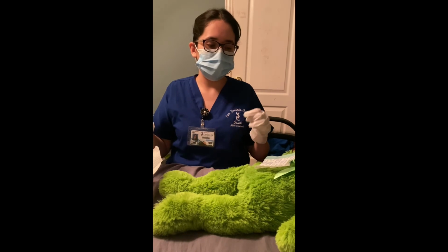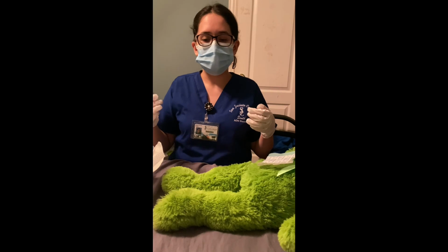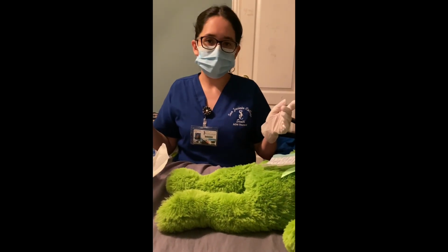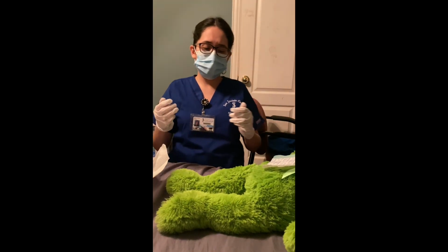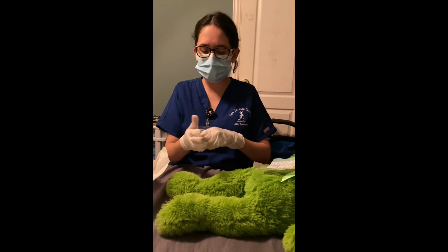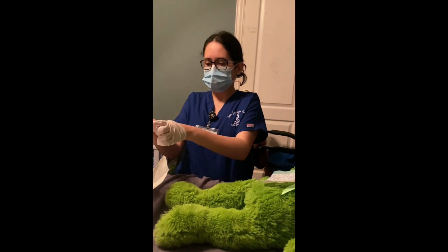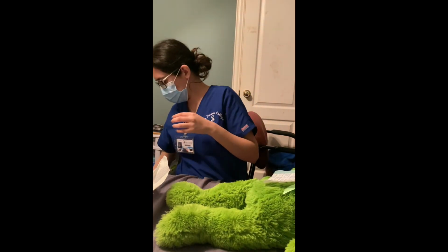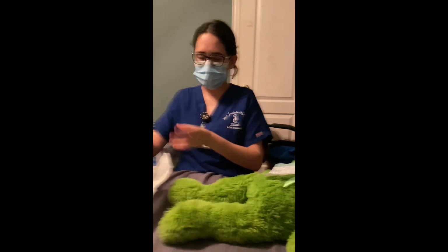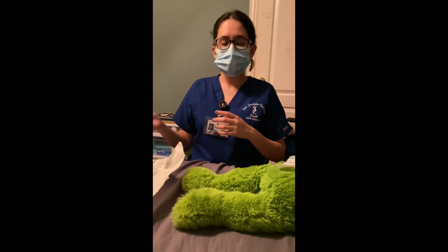Now that has been done, the patient tolerated well. There were no signs and symptoms of infection or complications when it came to doing the dressing change, and we remained sterile during the whole procedure. So I'm going to make the patient comfortable again, the bed in the lowest position, call light within reach. I'm going to remove my gloves, perform some hand hygiene, and I would put on some clean gloves and remove all of the supplies and throw them in the appropriate receptacle.